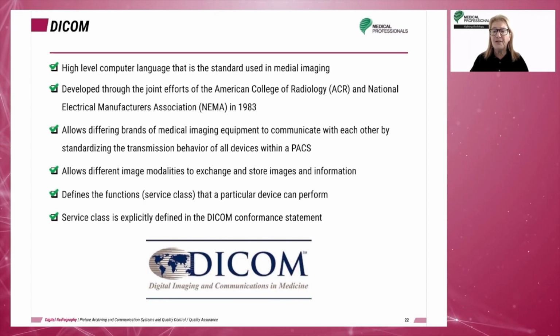Some vendors did not communicate with some PACS platforms. Vendors began to make available software programs that would facilitate the communication between imaging equipment and the PACS for an additional cost.